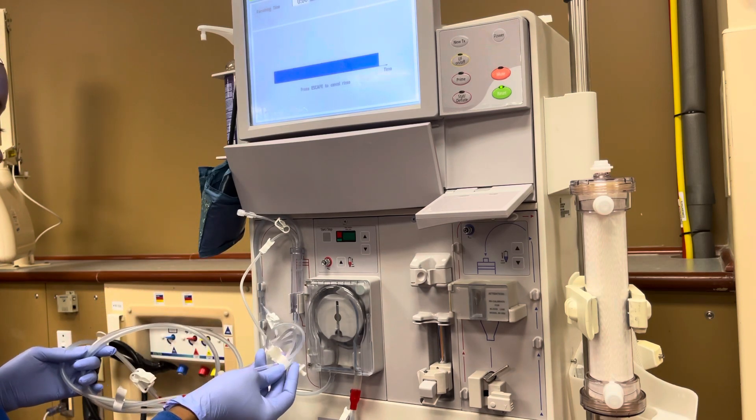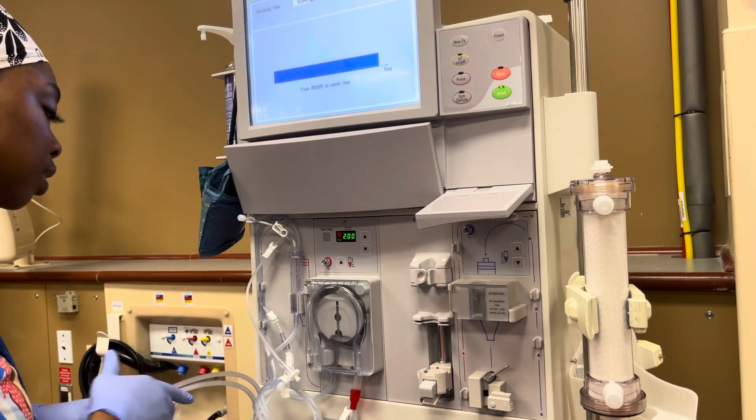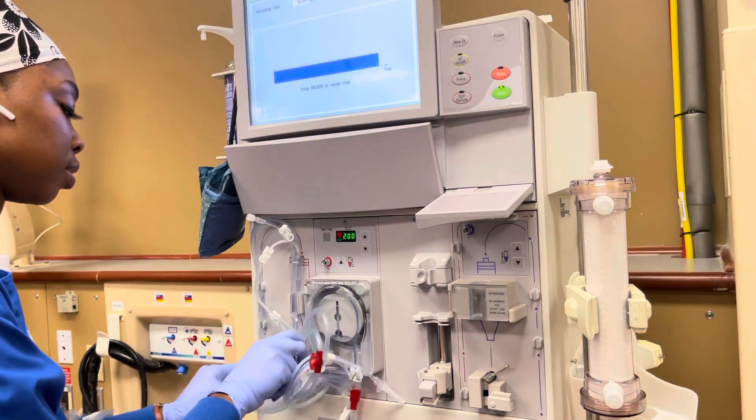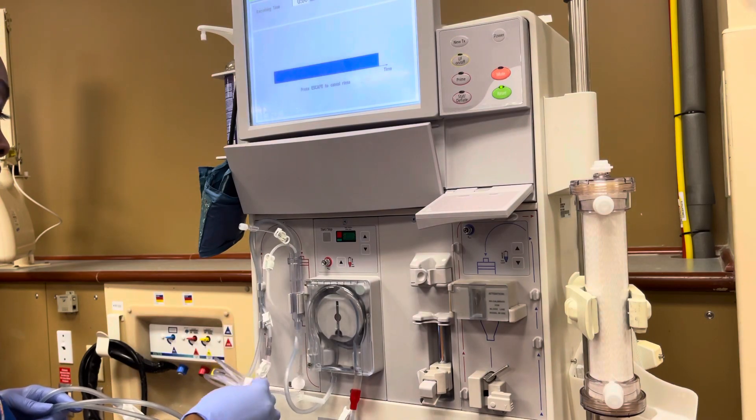That's your transducer and you don't want to get your transducer wet. So you're going to have these paper parts that are connected. Sometimes the lines come intertwined so it's all kind of mixed up like that, so I just took that apart.